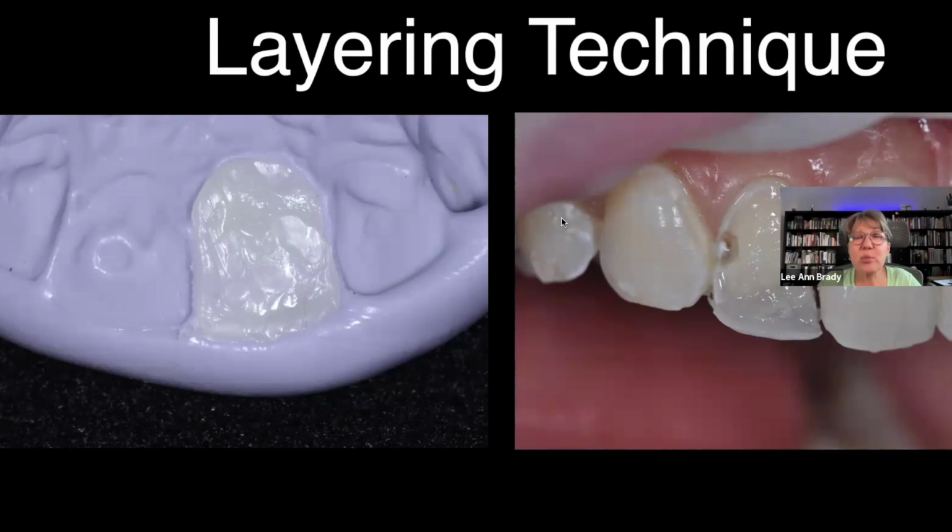How do you do it? You actually put the lingual layer of composite onto the matrix on a tray table, and then you seat it against the tooth. Now, remember, this most lingual layer, probably 3/5 of a millimeter, is what's going to stop the light. It's what you're using to create light reflection or opacity. You're going to notice when I've done it in the clinical photograph that I'm not bringing it through the interproximals because the interproximal of a natural tooth is more translucent. So I don't want a highly opaque composite.